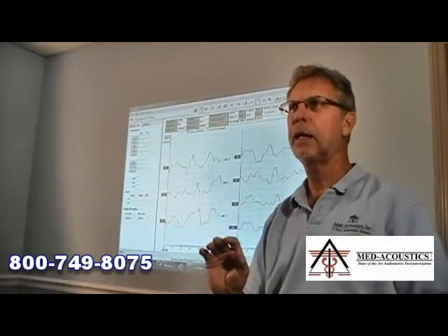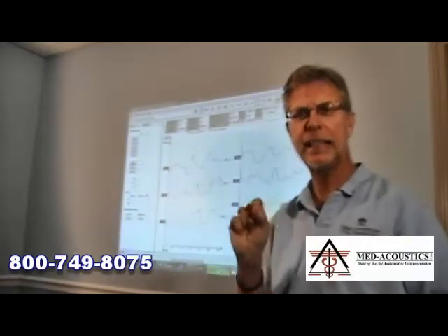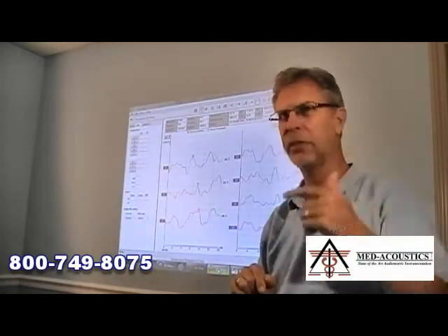I could tell you of a case in Gadsden, Alabama, where I tried to install another make and model, and I couldn't get a response whatsoever. In fact, in the EEG of the patient, I saw a modulation of a radio station. You could actually see the audio modulation in the EEG, and I heard the radio station in the earphones. It was a very extreme situation.